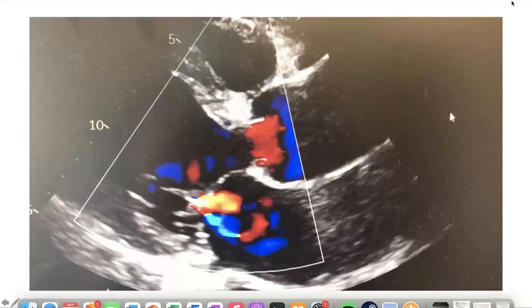Yeah, you're absolutely correct. As you know, usually the guidelines are about 10 years behind where we are clinically. At the moment, we're still in the midst of coming up with more robust studies with volumetric assessment, as opposed to being stuck with a linear dimension. And as you mentioned, the 50 millimeter, 70 millimeter cutoff for end systolic and end diastolic dimensions, or even the indexed ones.